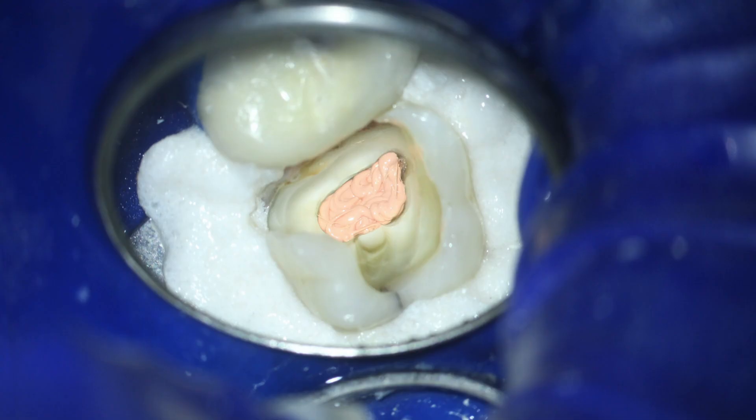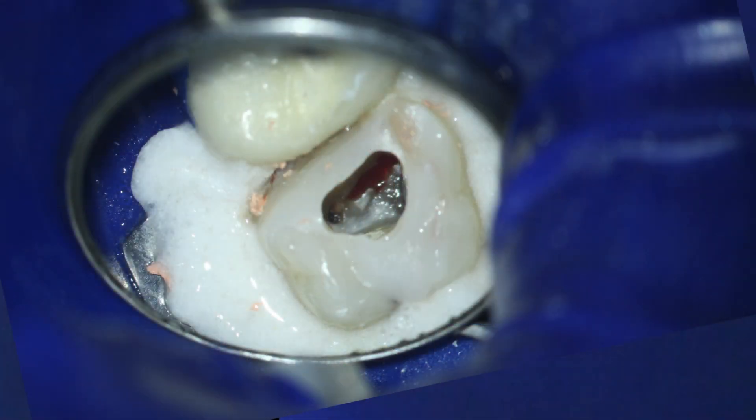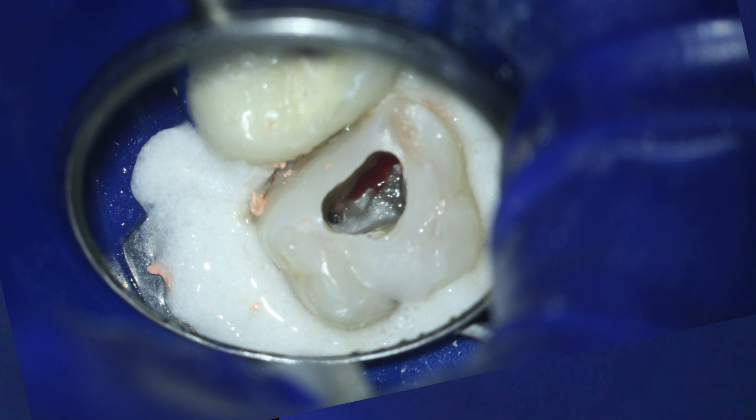Once I have enough material in place, we follow all the steps we normally would for any restorative dental work: etch, prime, bond. I tend to use a flowable composite resin, and I always bond it in place under aseptic protocol in a dry environment. I give my restorative dentist the option to leave my bonded resin in place and build off of it, or they can replace it altogether. You can see that just based on the addition of that material, we now have an environment that will contain those solutions and allow us to provide proper irrigation without things leaking around the tooth.